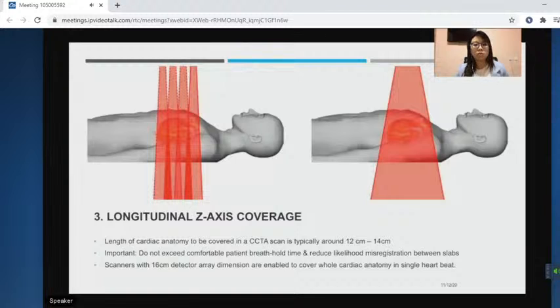As the table moves, the image is captured, and because the patient may release the breath, probably beat by beat, when they move, they may have misregistrations between steps. And the images may be inhomogeneous in the contrast volume.